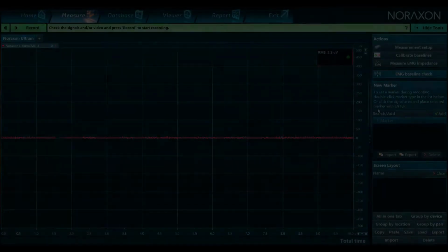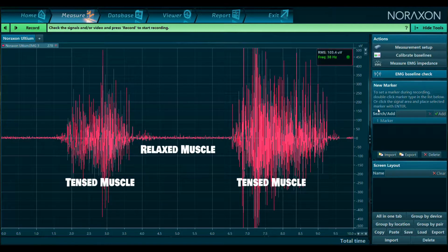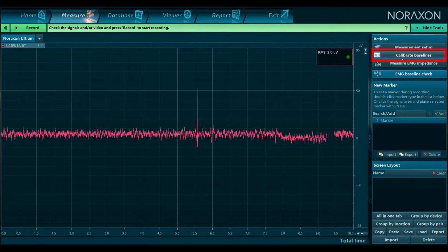Step 4. Check your setup. Before you start your record, take a look at your raw EMG signal for the tensed and relaxed muscle. Check if your zero line really is at 0. If not, check your software setup for scaling options.